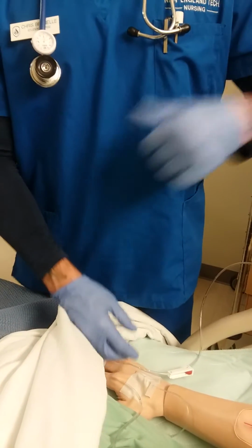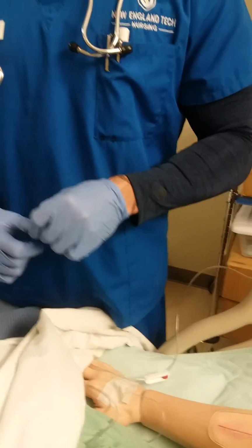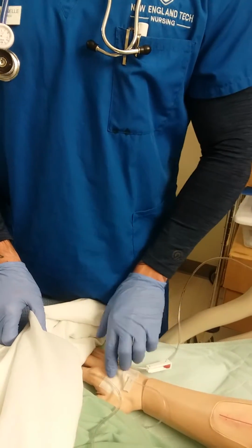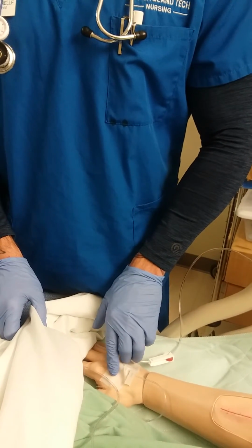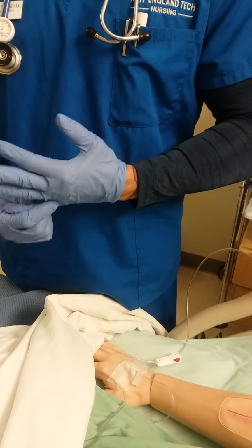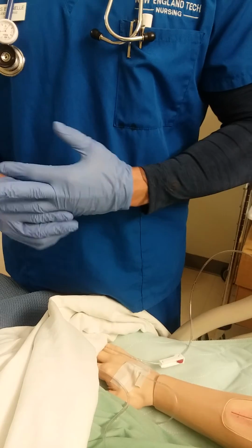At this time I would restart the IV pump if I needed to, which this patient wasn't hooked up to, so I don't need to do that. I would reassess the patient's IV site one more time. I would remove my gloves, wash my hands, document everything I did, and I would reevaluate the patient later.